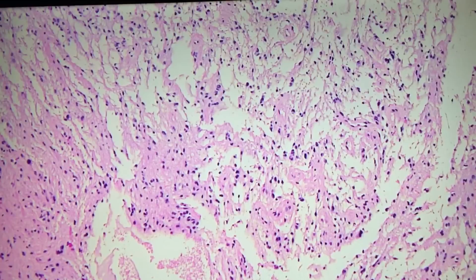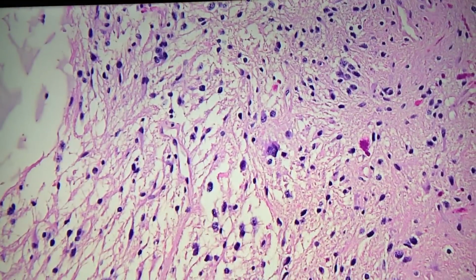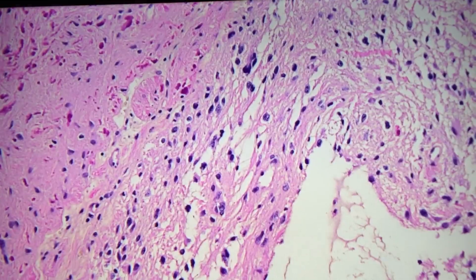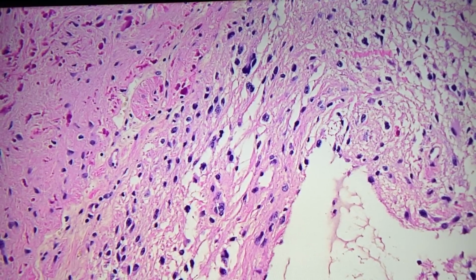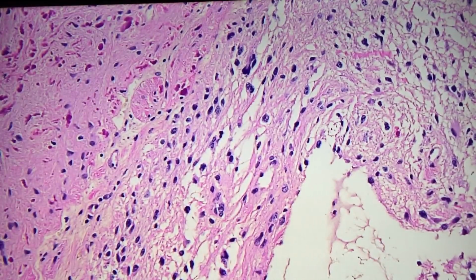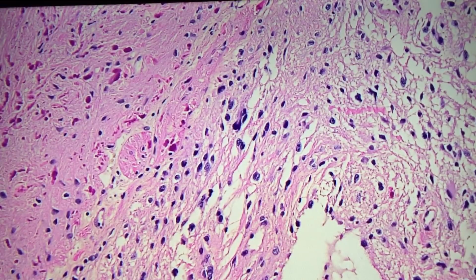All right. How about those, there was some atypia? Yep. Did we find some of the darker, slightly larger cells, like in here, maybe that big guy there? That could be an entrapped neuron, hard to tell. But pilocytic astrocytomas can have degenerative type atypia, where you get enlarged nuclei that look a little smudgy and dark. And they can be quite big, and sometimes on frozen section you see these big atypical looking cells, but there's generally no mitotic activity. These are otherwise very bland, and this is an example of that.